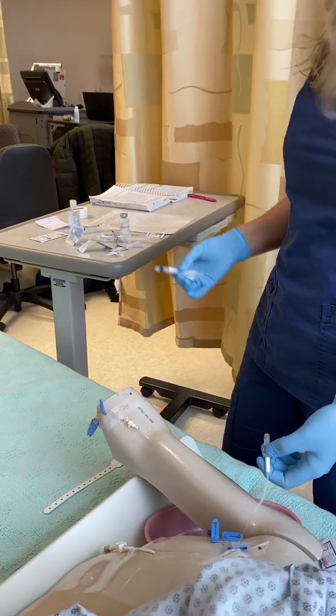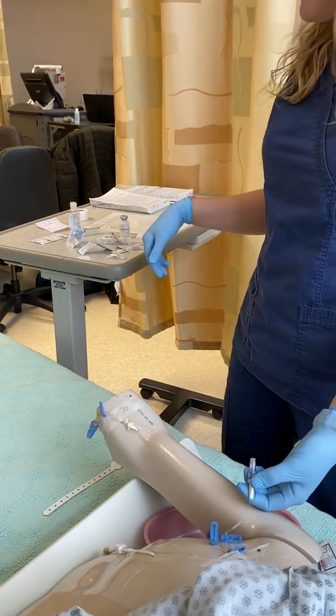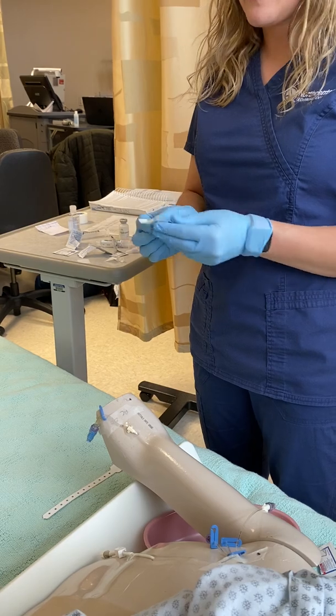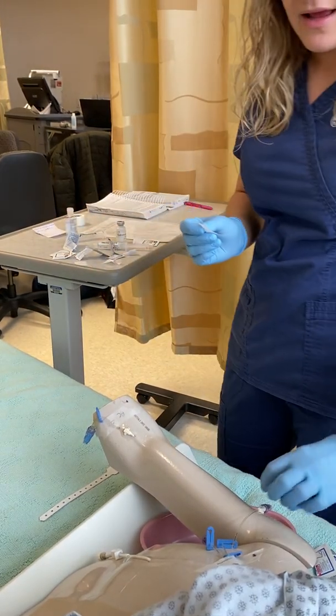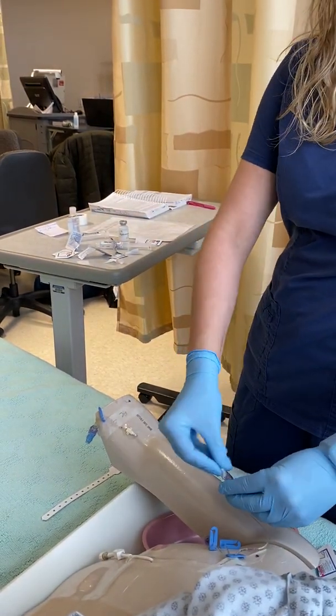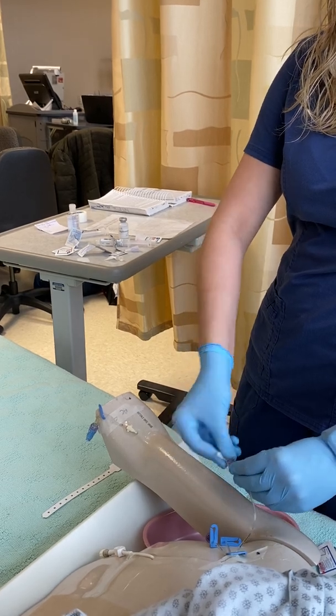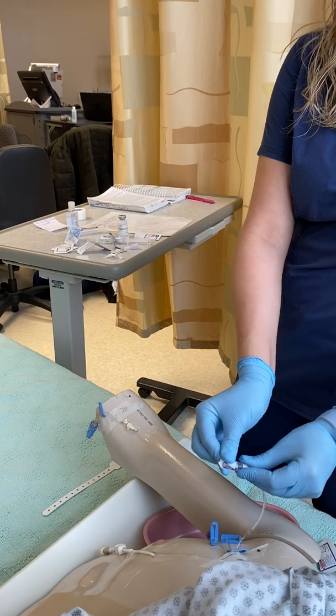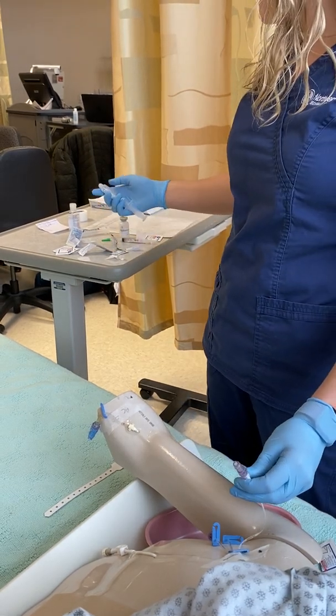Ask Bob how he's doing, if he feels any different. He says he is doing good. He does not have any dizziness. So I'm going to go ahead and clean again. And then we're going to take our second flush.